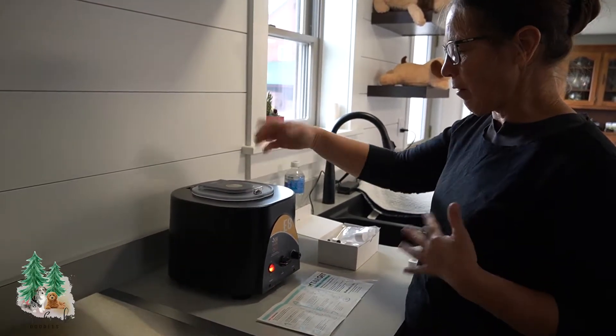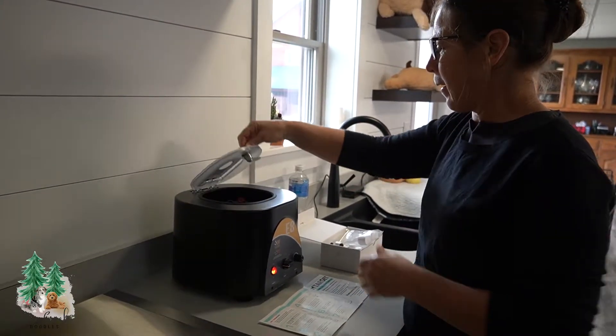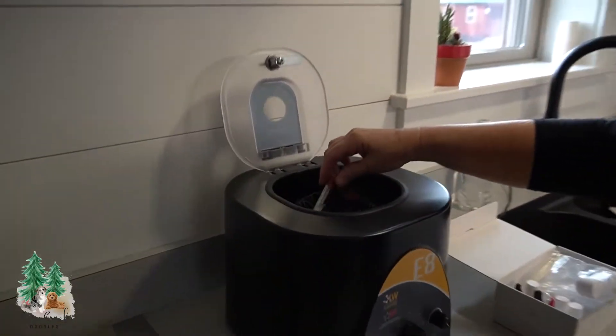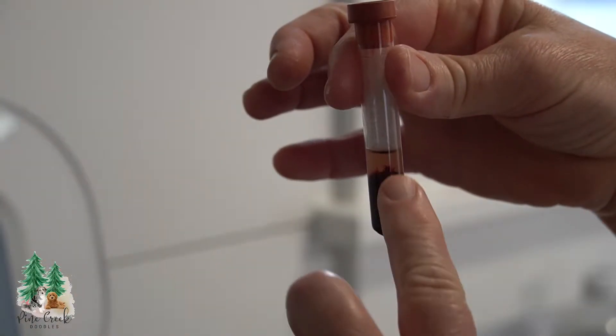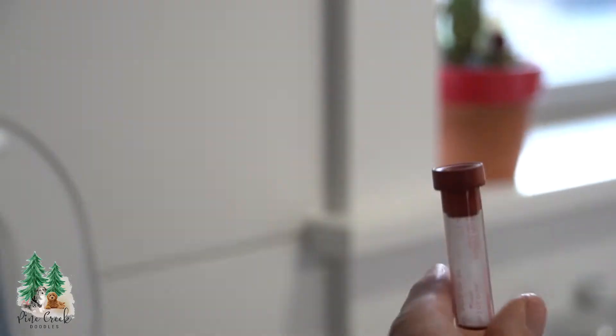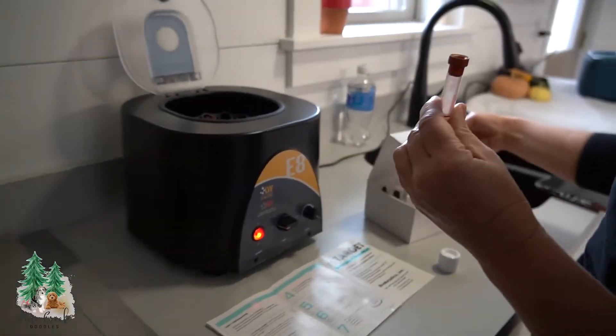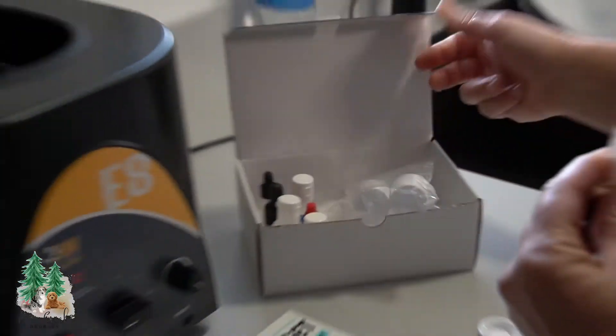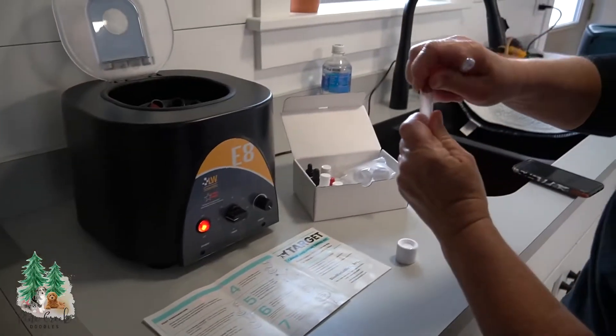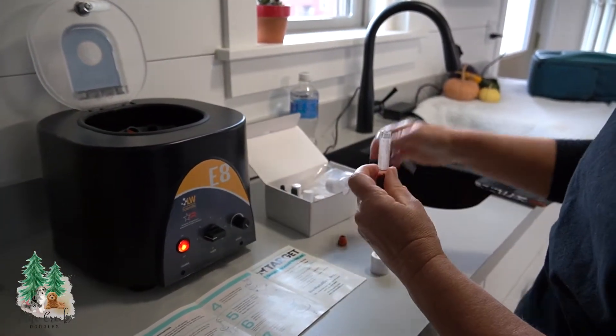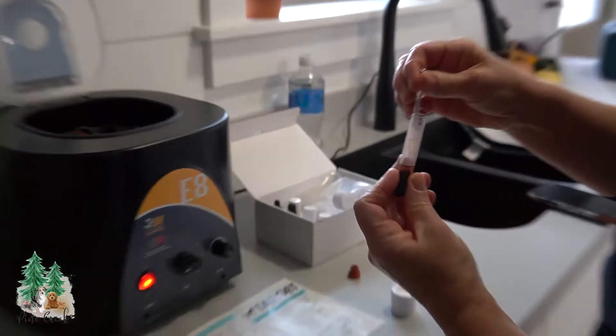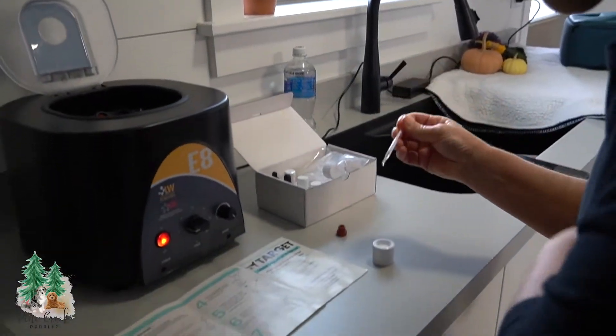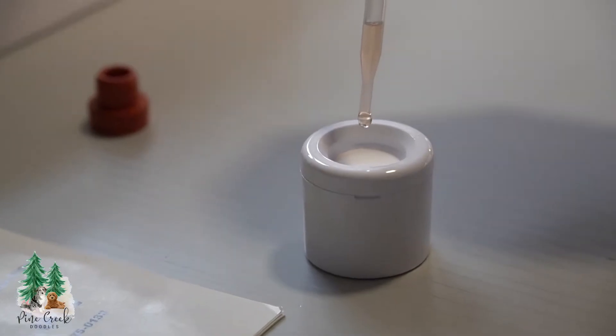That way I won't be collecting my male unnecessarily and I just draw blood from the girl and then I put it in a tube here and then I spin it and this makes the serum come on top. So then I've got a Target Canine Ovulation Kit here and I just follow the directions here. So the first thing I do after I have spun the blood here, I take some serum off the top here and then I put four drops of the sample on the top here.